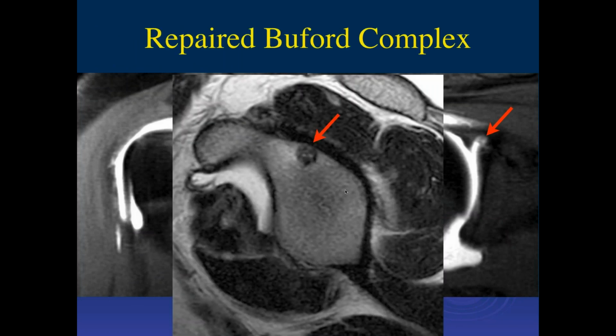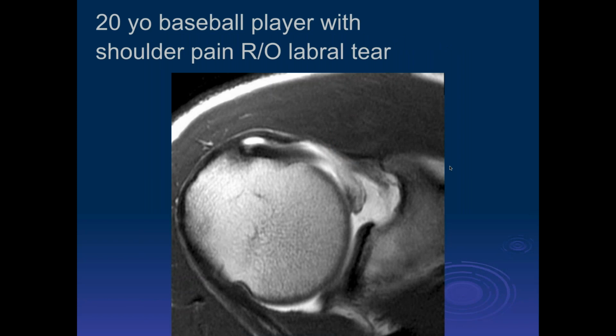Okay. I wonder what they were repairing. Yeah, that's just what Sam asked, John. I think they were repairing the superior recess here. Well, but it doesn't go to the recess, or at least it doesn't look like it goes there. Yeah, right.